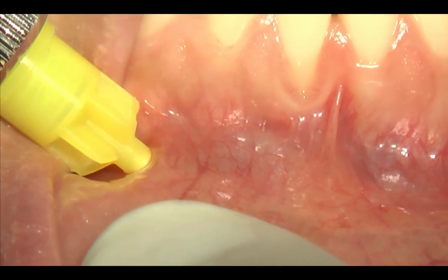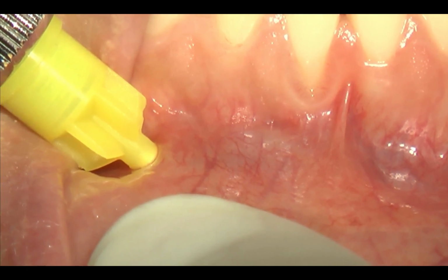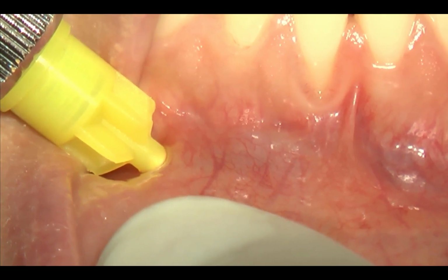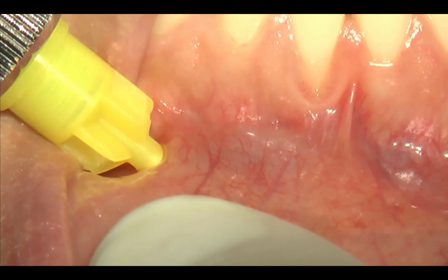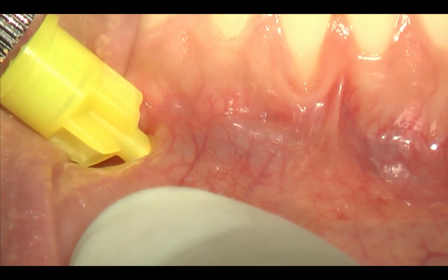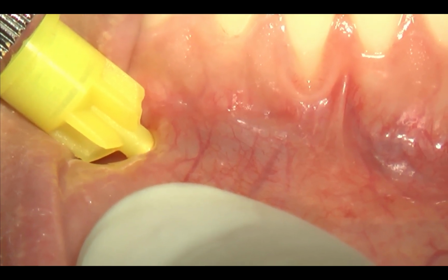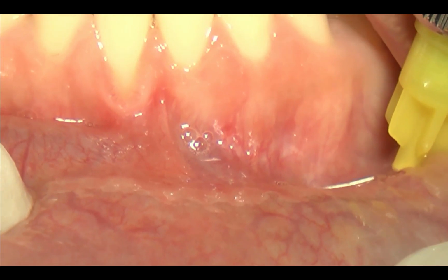You start to see that the lining mucosa of the lip is swelling. Lateral and canine on the other side, and we make the same thing.